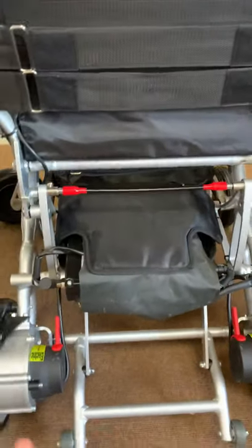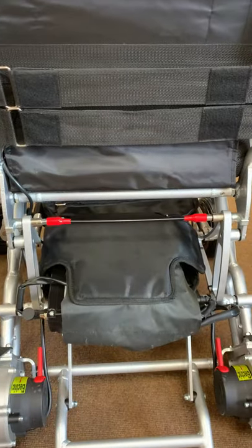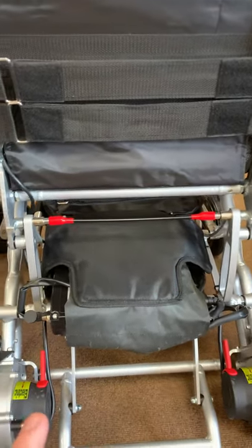If both batteries are connected, like on the Compact, you will use both batteries' power equally when using the chair, and also when the chair is being charged it will charge both batteries equally.